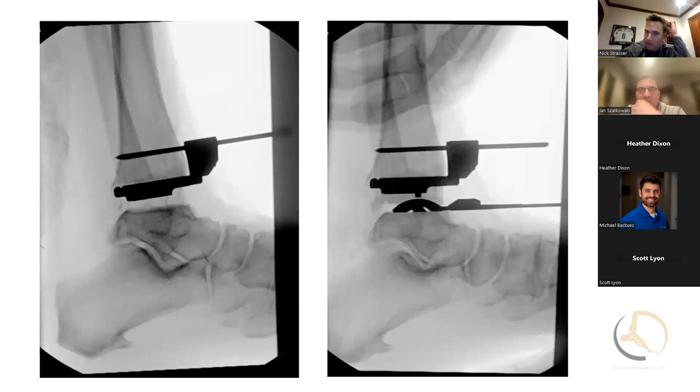After my resection I'm pretty happy. Most of the time I'm going to go with the longer implant to maximize my anterior-posterior coverage. There's a question — Graham asks how often are you doing coupled pinning with uncoupled cuts during your total ankles? This one I coupled, but most of the time I uncouple the cuts. I've been doing the same thing — when I did my training we used to just couple them and it would work fine, but now I tend to do them separately.